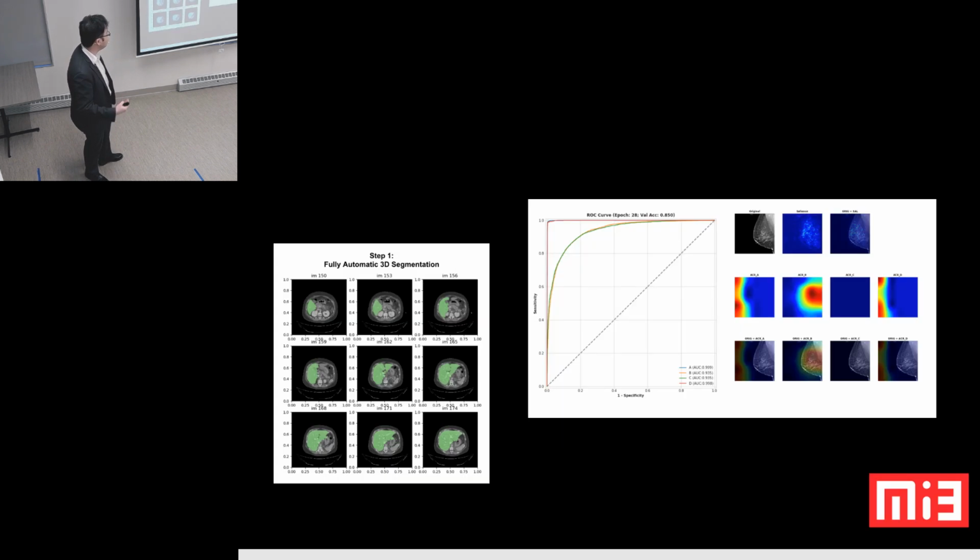So what we've tried to do within radiology is get very, very familiar with these methods to better understand them and figure out what we can actually apply them for. We have some early projects where we're trying to do, for example, automated liver volume quantification, trying to figure out whether there is fatty deposition or not, quantifying breast density and so forth, and doing it at a particular accuracy, right?